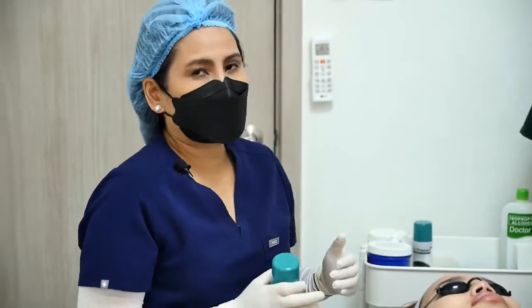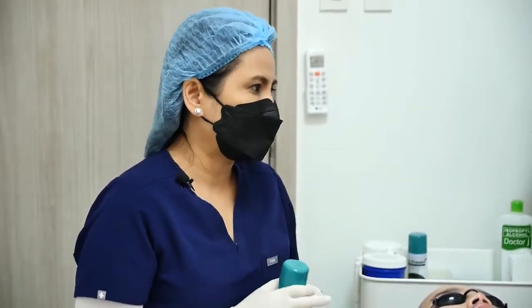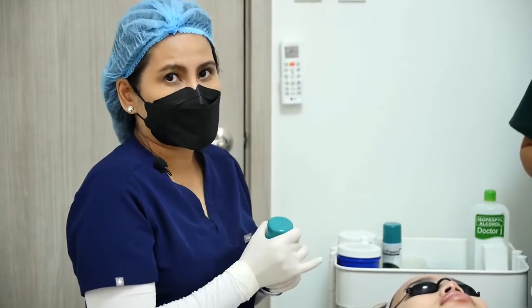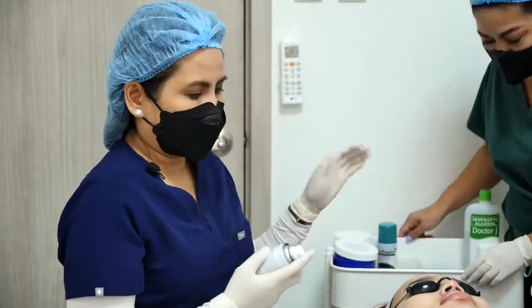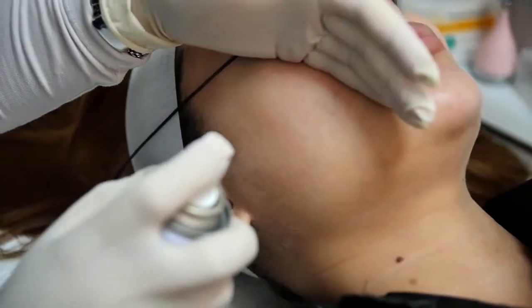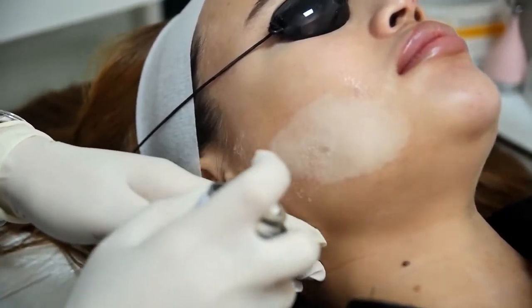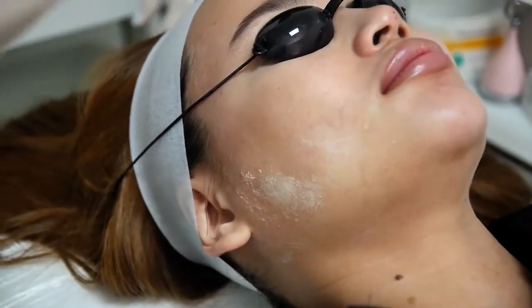So we're here with Casey and we are doing the Ulthera treatment for her face contouring. I'll use Pain Freeze as my topical anesthesia to help reduce any pain or discomfort. It's easy to use — we just spray on the skin where we will be doing the Ulthera treatment. I'll be working on the lower third; spray until it turns white and it gives an instant numbing effect.